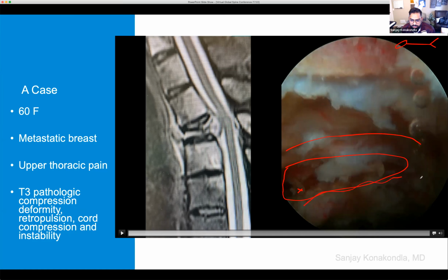All this, as we play the video, is the remaining portion of that ventral tumor. Essentially what we're doing is working in this area, so we're going to see this ventral portion of the tumor. We took the drill and drilled around this area, so you'll see that deeper hole around 4 to 6 o'clock in this video. We'll bring that back.